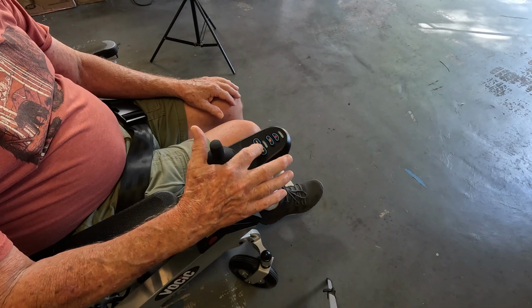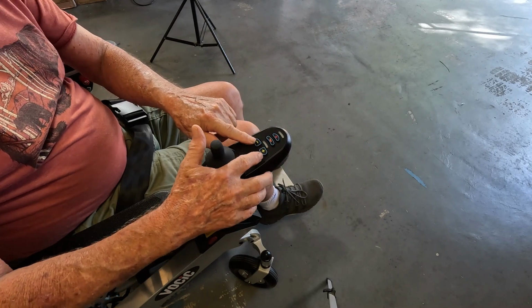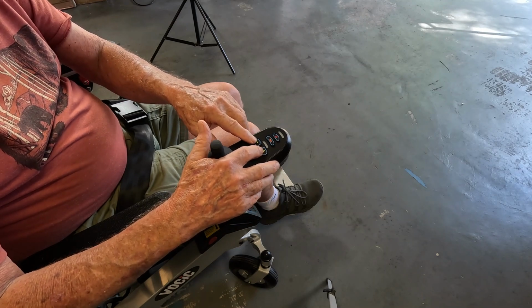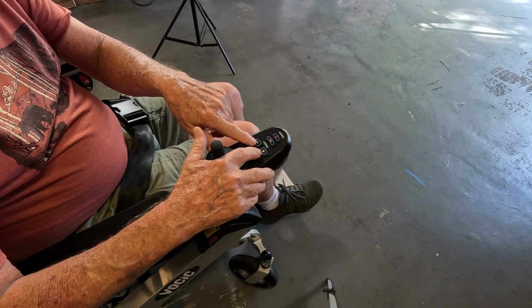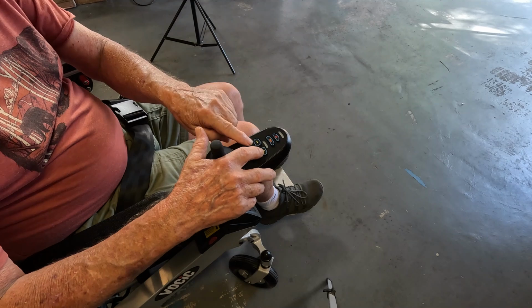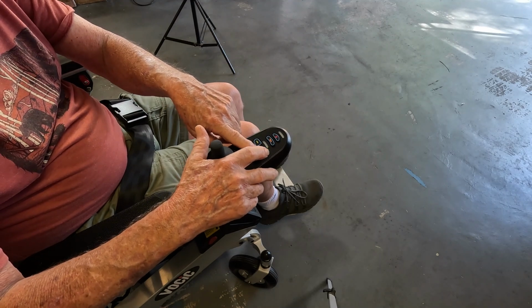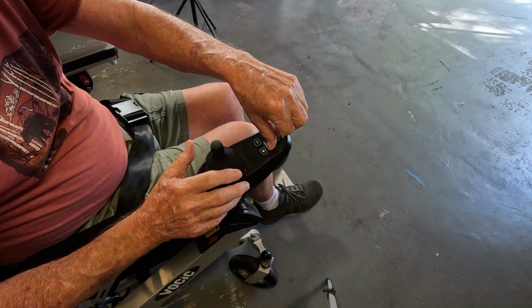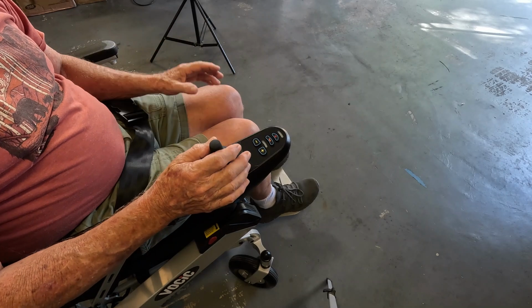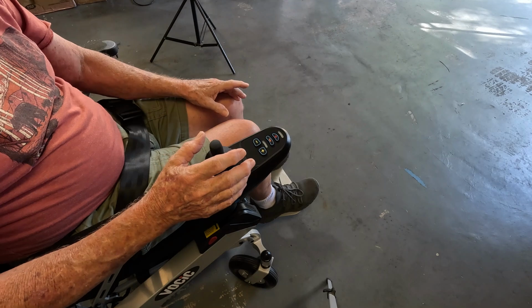This right here is your speed control, and here's where it is registered. If you're inside of a house or like a restaurant or a grocery store, then you may want this on the lowest setting. If you're traveling on the road and you want to go the full 3.75 miles per hour, then you want to move this up until you're all the way to the end there. It's easier to control at very low speeds if you're wanting to move around obstacles.